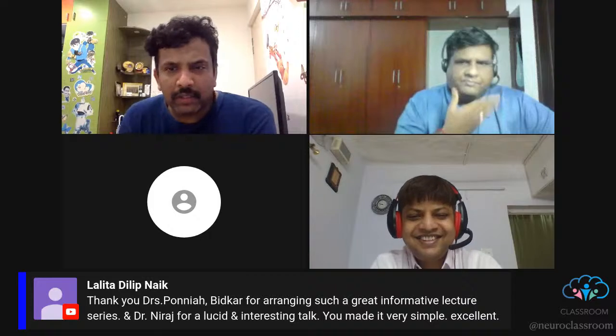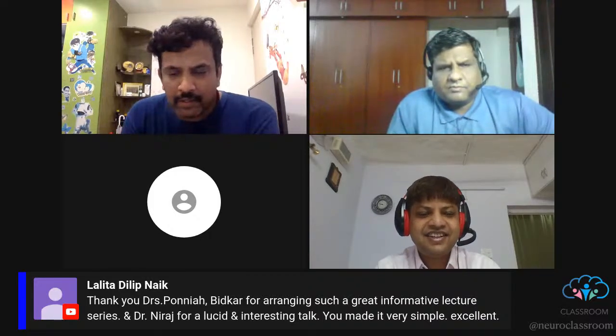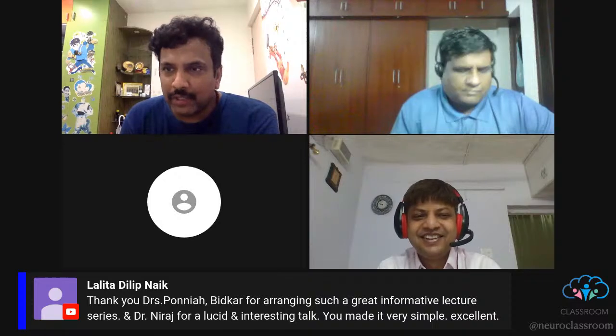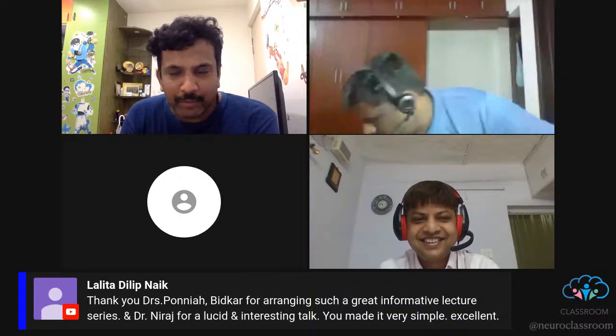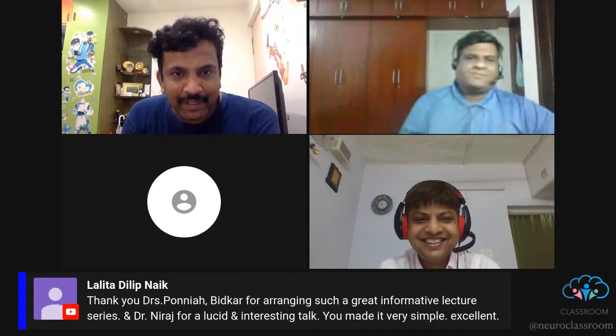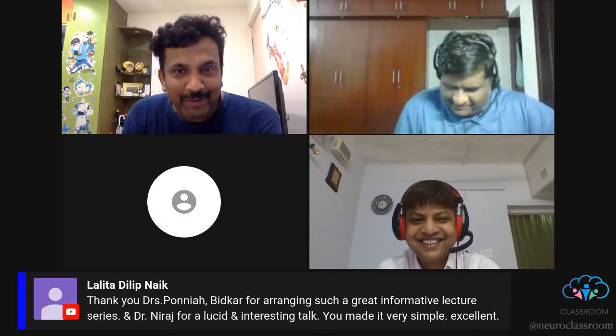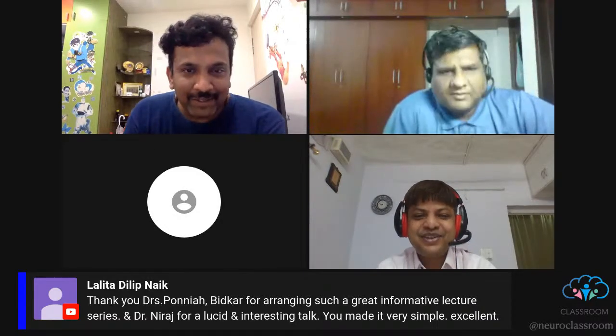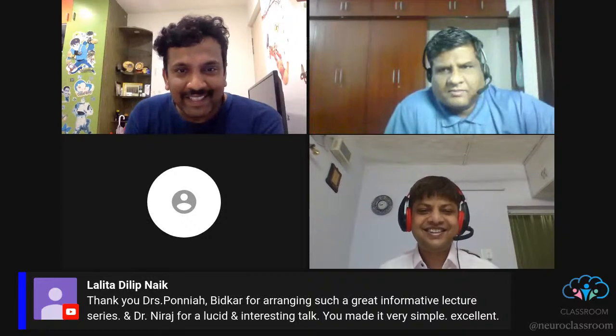I think we'll have one session on troubleshooting, because once viewers see the beautiful images, they'll just go and put the probe, and they will not get such a beautiful image. Then they'll get depressed. So in one session we'll have troubleshooting, on how to obtain a good image. Okay, I will try to do that.